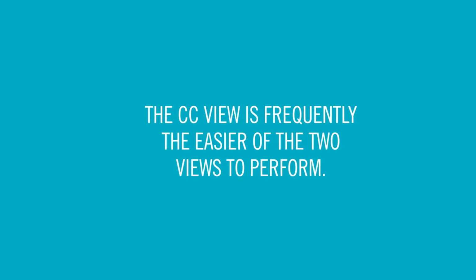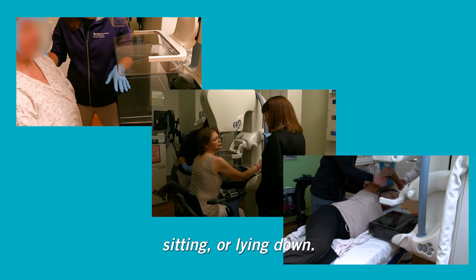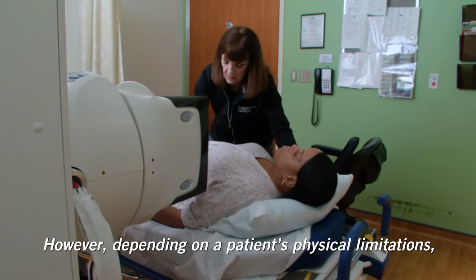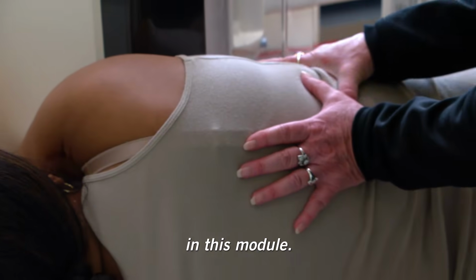The CC view is frequently the easier of the 2 views to perform, as it can be accomplished with a patient standing, sitting, or lying down. However, depending on a patient's physical limitations, modifications may be necessary, as demonstrated in this module.